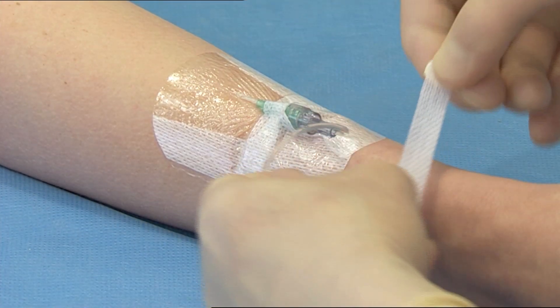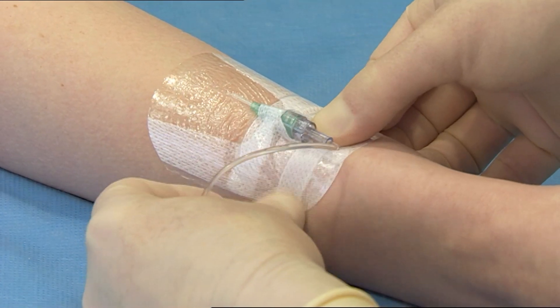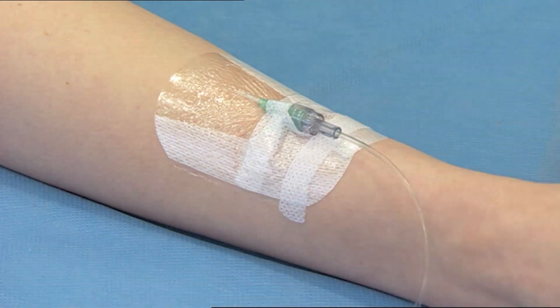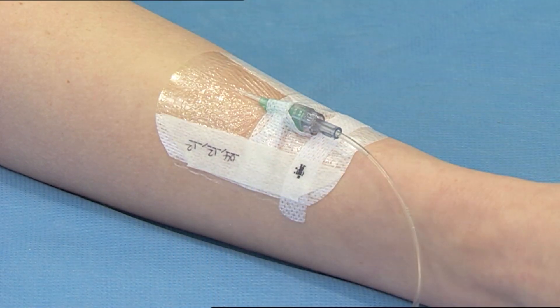Remove the second sterilised securing strip from the frame and place under the catheter hub and across the soft cloth section to double secure the catheter. Date the recording label and place along the dressing for documenting dressing change.